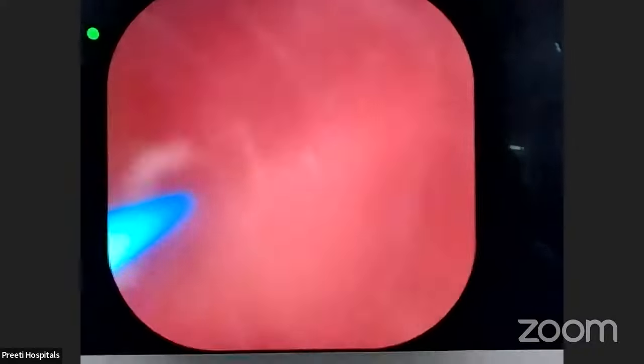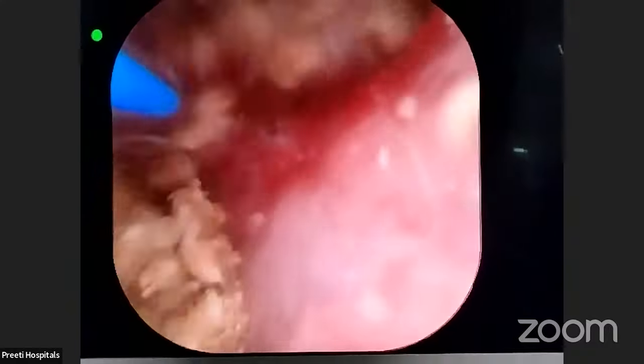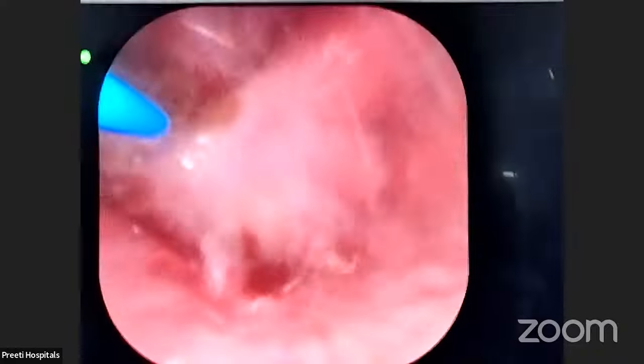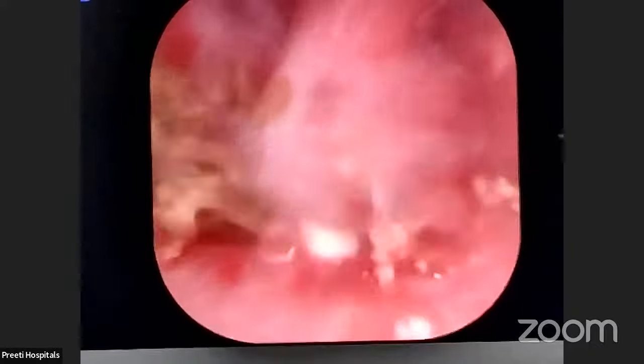In this, what happens, you have to suck the scope. It is very difficult to suck this many fragments. You got the point? So, do you think, Ramakrishna, they can all be sucked out? Then I will take out the laser fiber. This is the first time I am taking out the laser fiber.